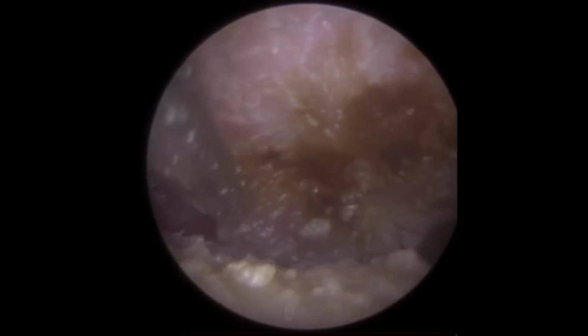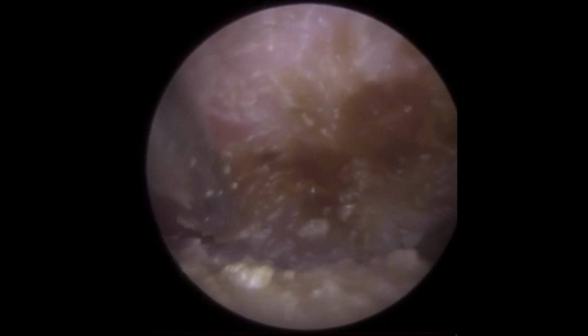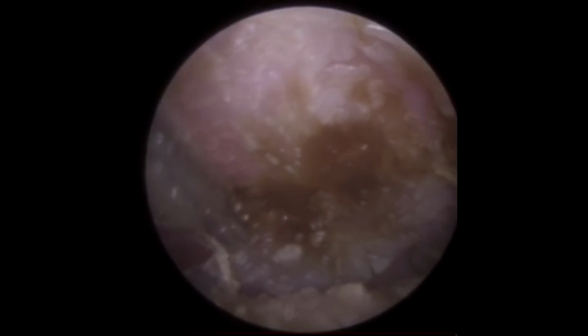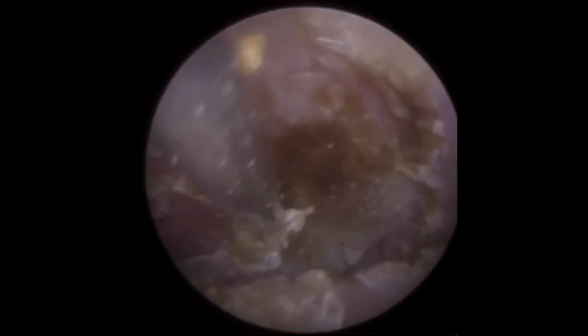In the UK, we try to use suction or other instruments, even if it takes a bit longer and it's a bit more tedious. We just find that works better. I'm sure there are some specialists in the UK that still use dry mopping, and that's fine. It's just, I think, more people don't than do in the UK for that particular reason.